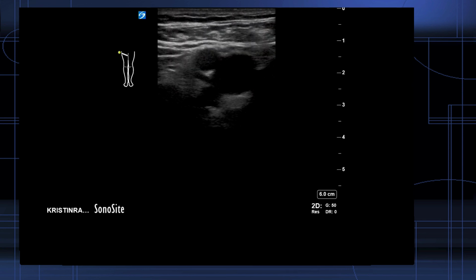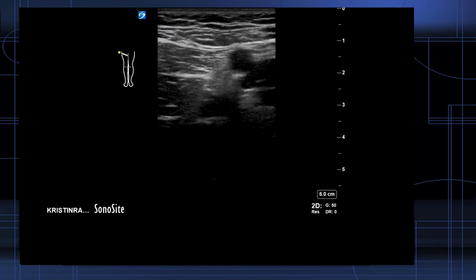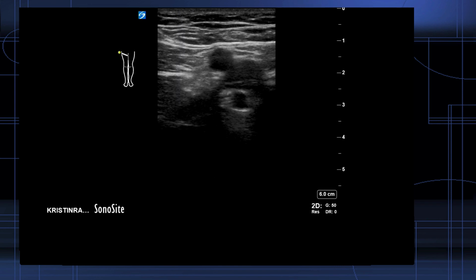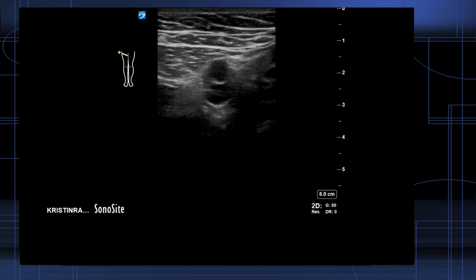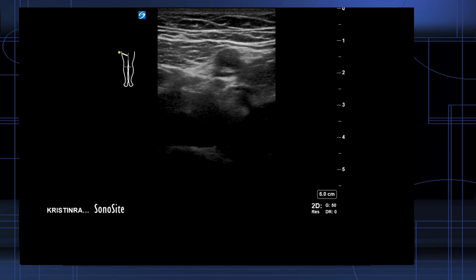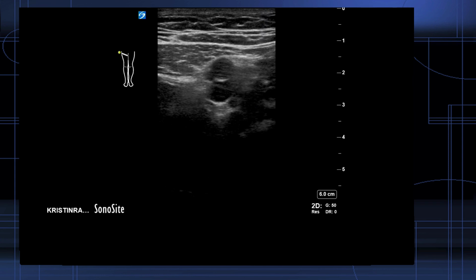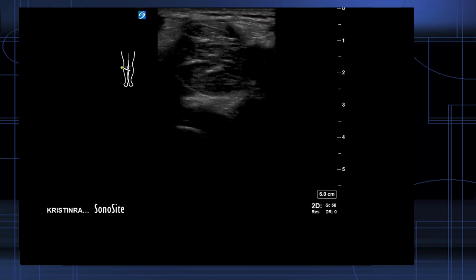On each leg, scan the femoral vein and popliteal veins, ensuring collapsibility. In this case, I'm scanning the patient's right leg. Obviously, you would do this bilaterally. This scan in particular is relatively thorough, and it still doesn't take too long. The key at the femoral veins is to look at the branch points, since that is where clot tends to accumulate.